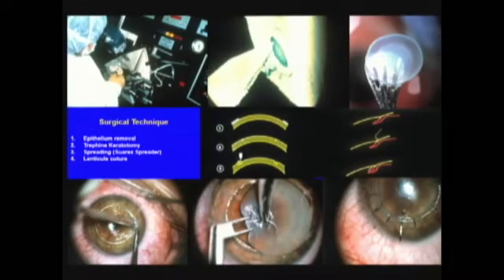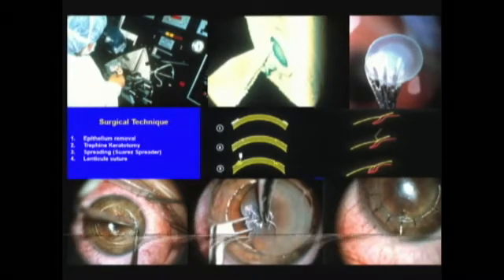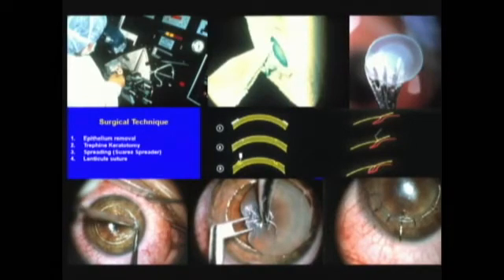And the same, but instead of taking part of the patient's cornea, we took a donor cornea. We freeze it and lathe it, and then we remove the epithelium of the patient's cornea, create an annular keratotomy with trephine, and with the Suarez spreader do a lamellar dissection, a pocket, to introduce the wing of the lenticule in place and suture back.